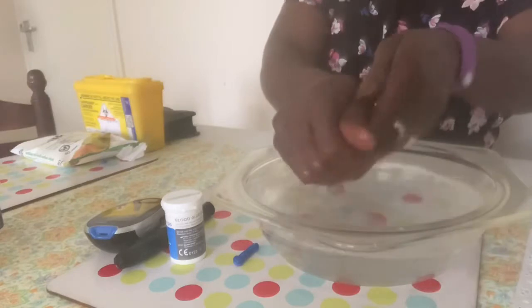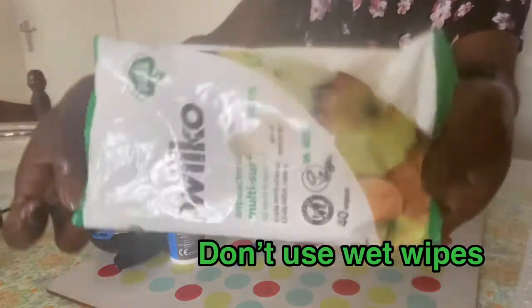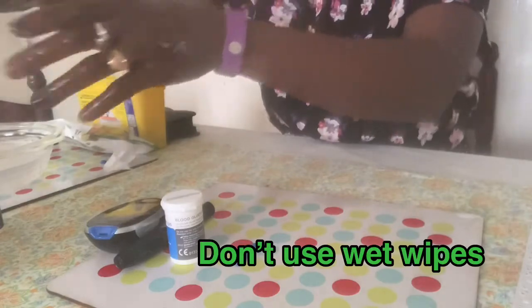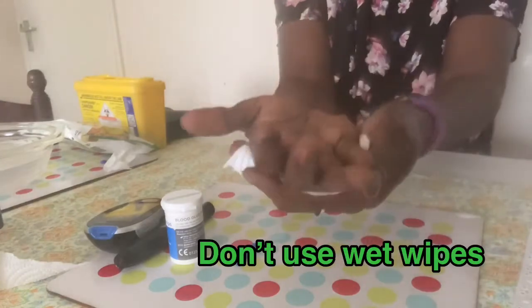The next step is to wash your hands with soap and warm water. Don't use wet wipes, as the glycerin in them can affect the test results. Make sure your hands are warm so it's easier to get blood flowing out.